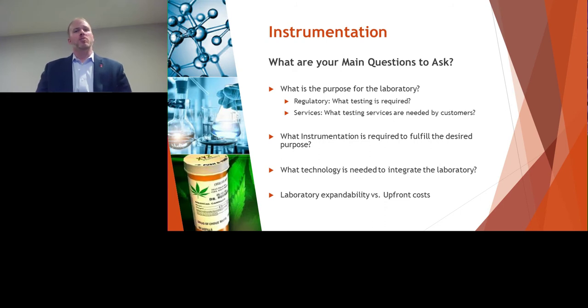And other times you don't want to be buying instrumentation that is inferior and won't get you the information that you want. So keep those upfront costs in the back of your mind. And then also as you're pulling in laboratory equipment and instrumentation, try to think about other technologies and how you're going to integrate everything to speak to your systems as a whole.